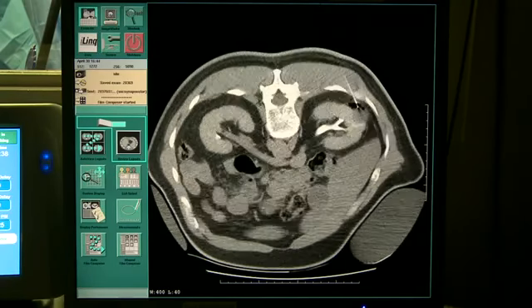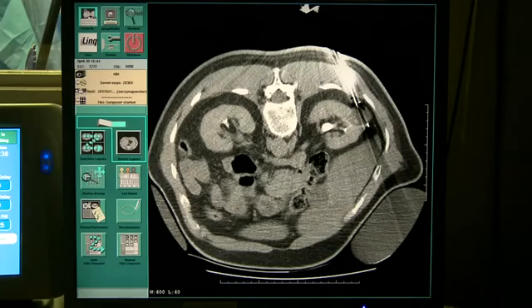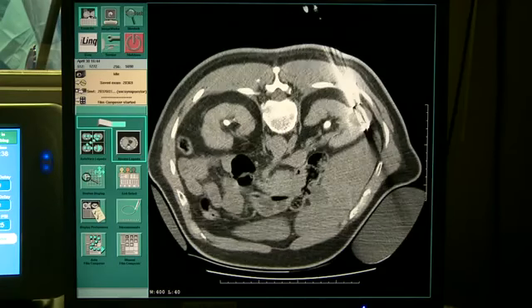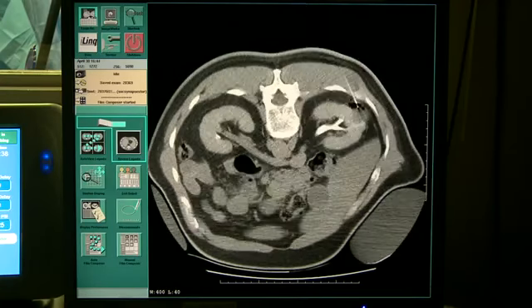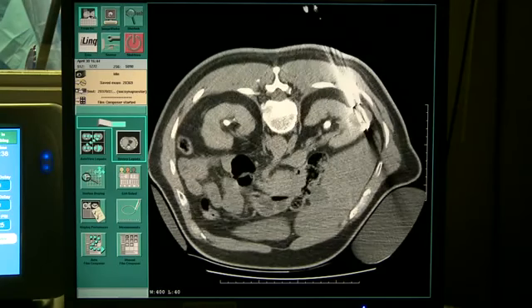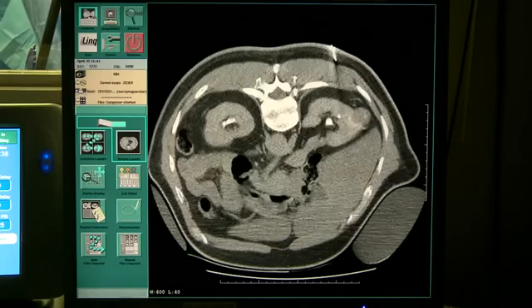When I make plans for these procedures, I'm always willing to change them. Where the probes end up and where you want them to end up are not always exactly the same thing. And since you're treating cancer, I always assume that these are cancer. Putting an extra probe in at the end of the procedure that you weren't planning on, if you think of it, do it, because you don't want a recurrence. You don't want to leave it untreated. It's a lot of work for everybody to get here and put these probes in.